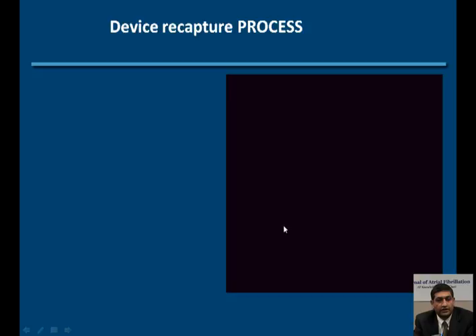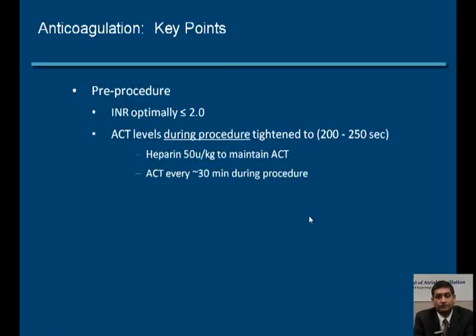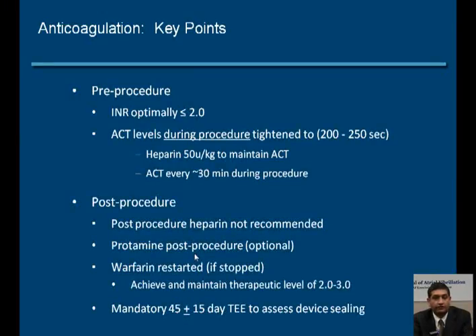So in conclusion, PROTECT-AF trial evaluated the WATCHMAN device and compared it to warfarin therapy. It was the only study comparing a device to drug for stroke prevention of atrial fibrillation. It was a prospective randomized controlled study of 800 patients, and 87% of patients who were implanted successfully were able to discontinue warfarin therapy. And in terms of both safety and efficacy, the efficacy events were 30% fewer in the WATCHMAN group, and the stroke risk was 22% fewer in the WATCHMAN group. So it did compare favorably to the Coumadin arm, and it did meet the non-inferiority criteria.